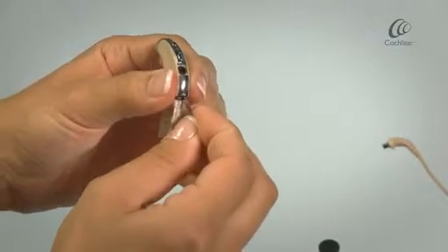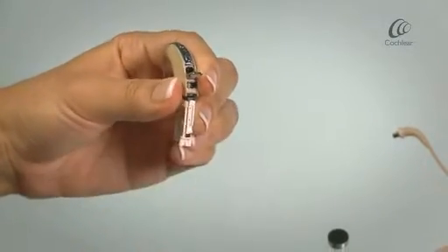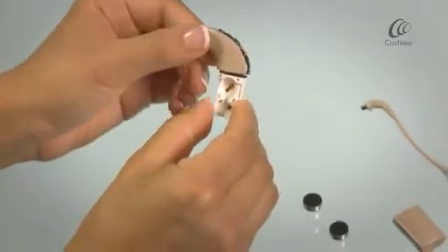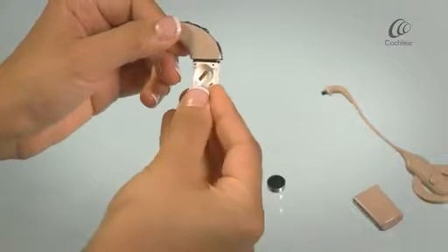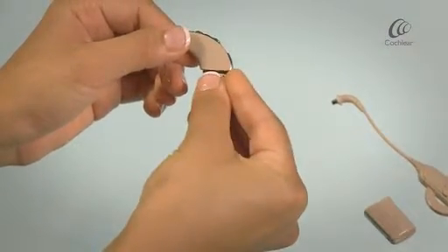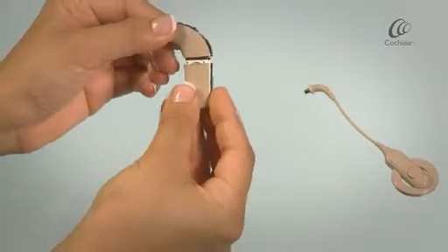Lift the accessory socket cover upwards. Move the lock to the left and close the accessory socket cover. Insert the batteries with the flat side facing outwards. Attach the battery cover.